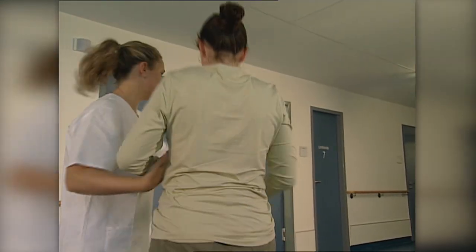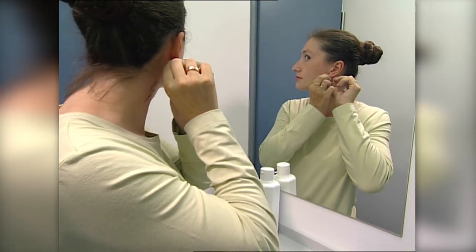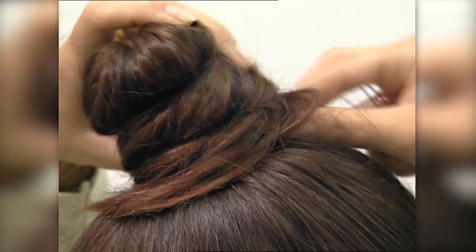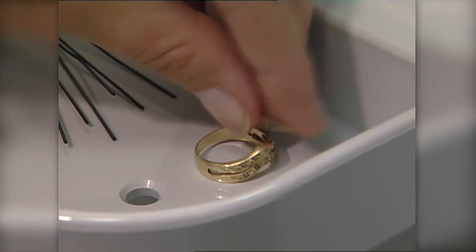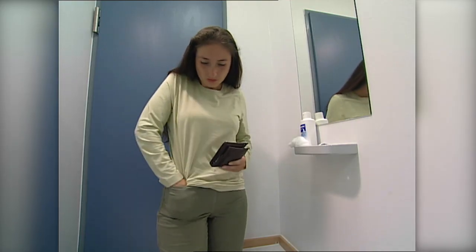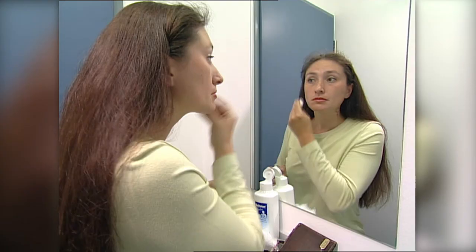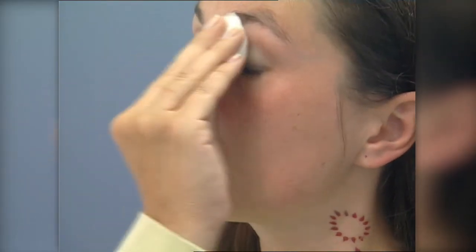Before entering the examination room, patients are required to remove the following objects from their person: cell phones, beepers, watches, jewelry, hearing aids, garments with metallic fasteners, hooks, wires or threads, metallic patches delivering medication, barrettes, hairpins, wigs, and prostheses. Makeup and deodorants containing metal alloys must also be removed.